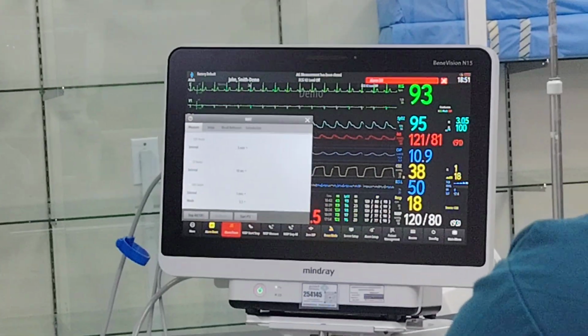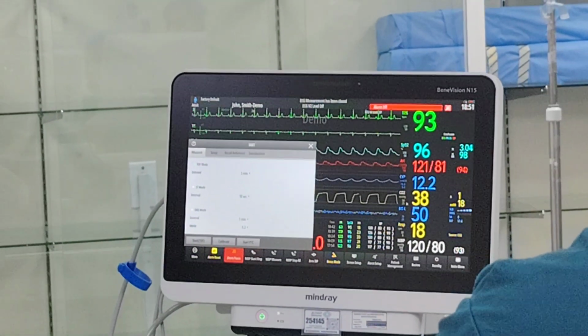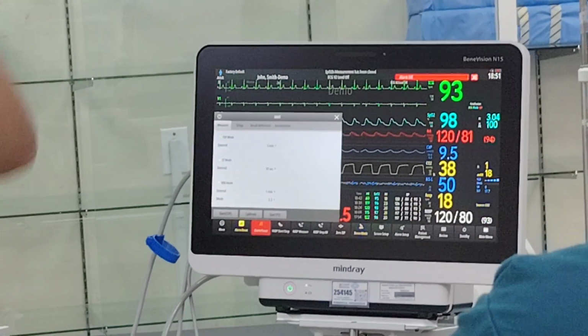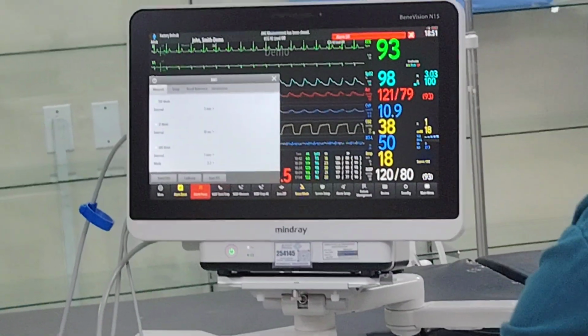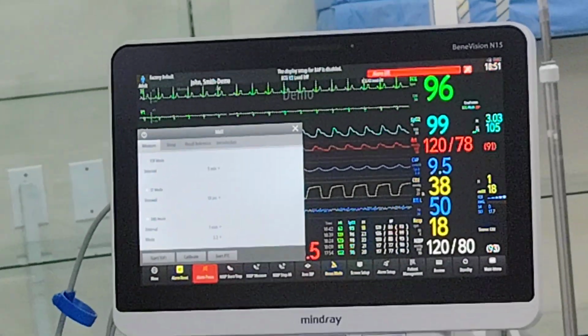You want to go more in deep block, you look at post-tetanic count, you click here, it will do ta ta ta ta 20 times, and then you will see the numbers. The higher the number, the more response there is. The lower the number is, the more the patient is blocked. Okay? This is just a few things for you to know.